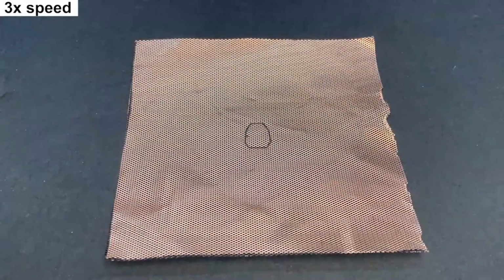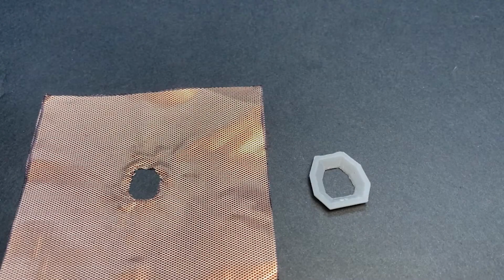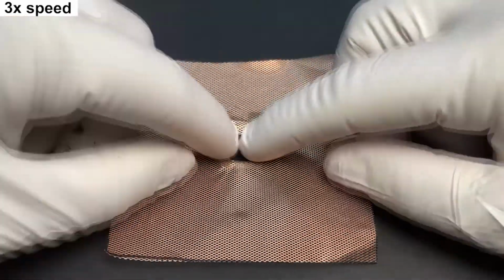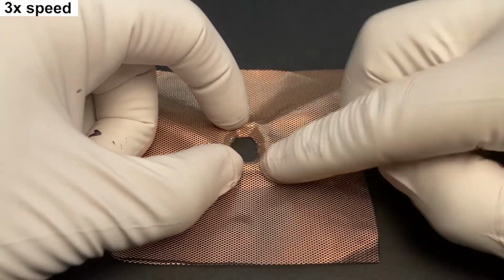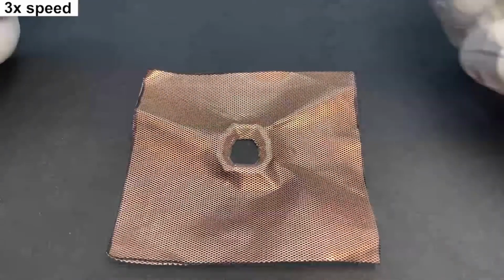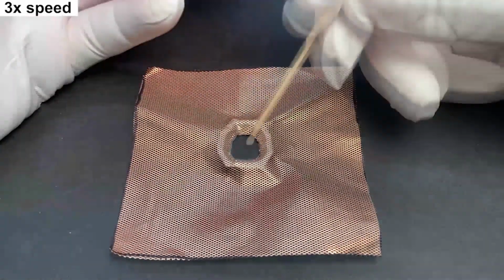So we use this 3D printed plastic base, and then we attach to this 3D printed plastic base 6 by 6 centimeter copper mesh, which will later on act as a Faraday cage. And then we cement together the copper mesh with this 3D printed plastic base. And this will be put on the animal's head.